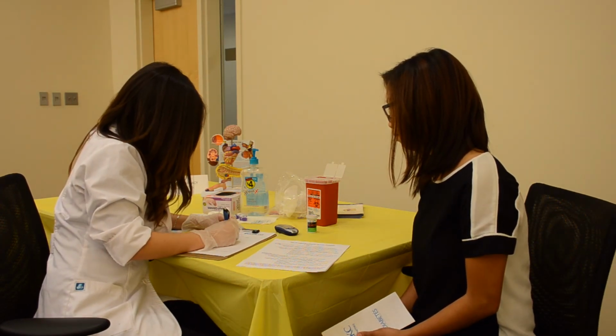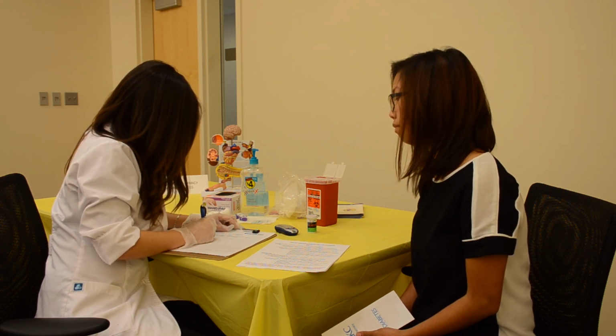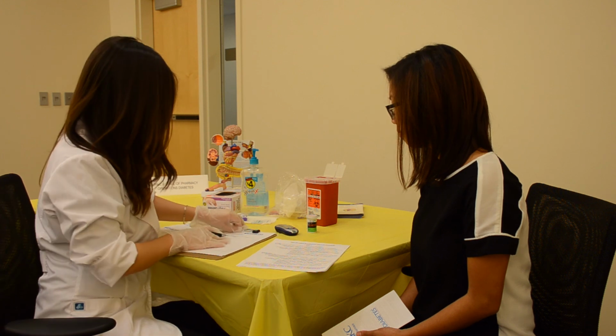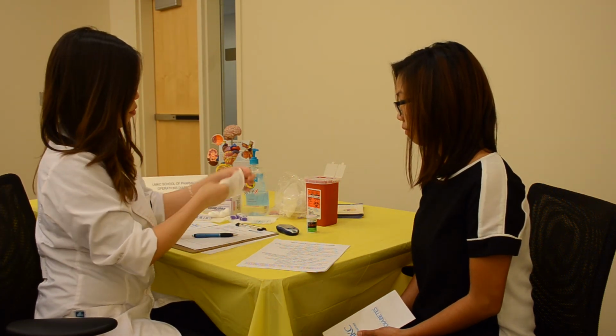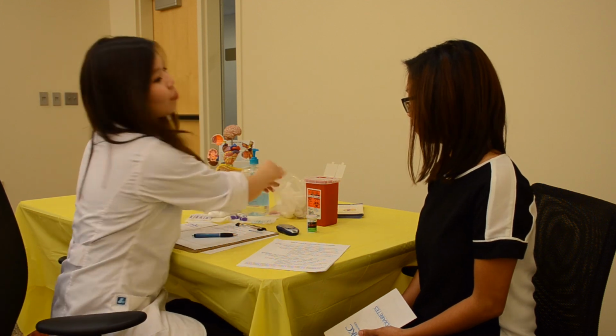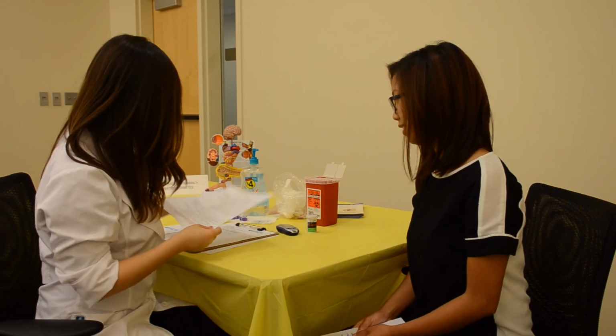Record the reading result. Indicate a referral on the event log if the preceptor or pharmacist comes to speak with the patient, and they are instructed to visit their primary care provider. Thank them for their time and use every opportunity that presents itself to advocate for pharmacists as healthcare providers.